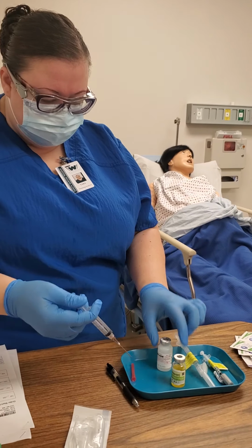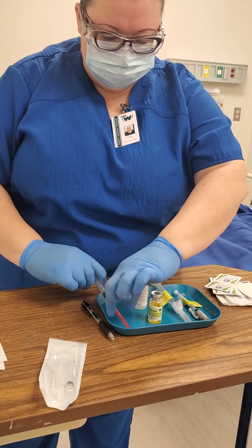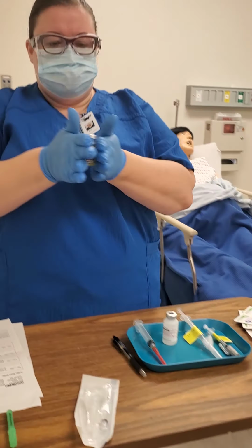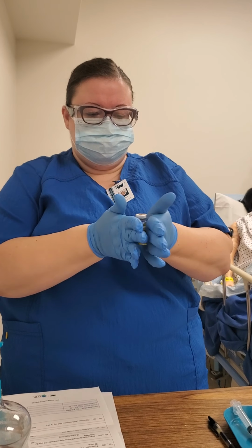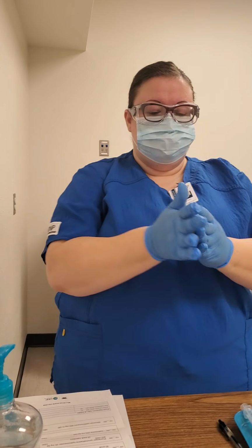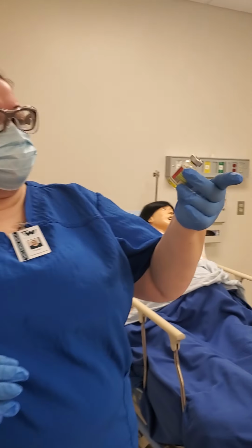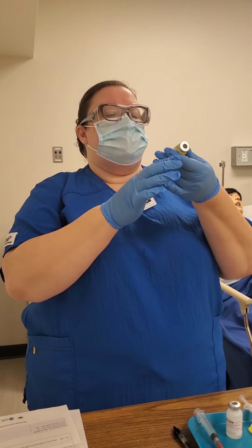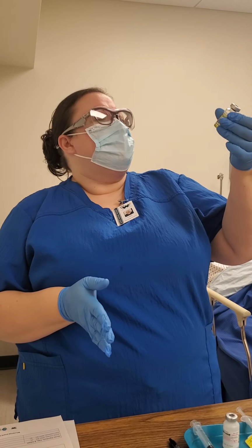Okay, and then I'm going to recap this needle. And then I'm going to mix my solution up a little bit here. Okay, and then that looks pretty much mixed up here. I had a little powder in the bottom.